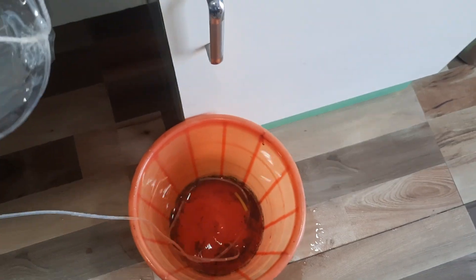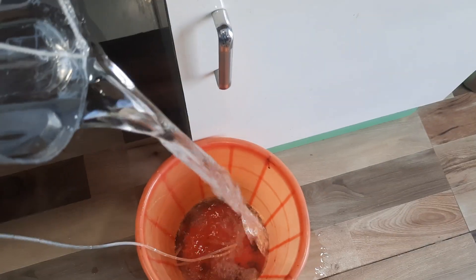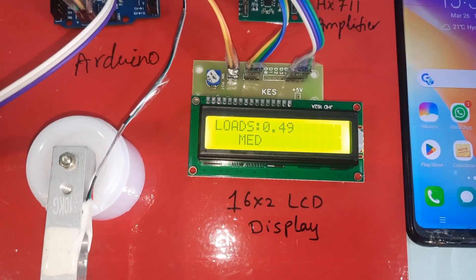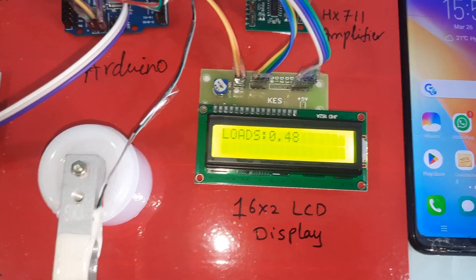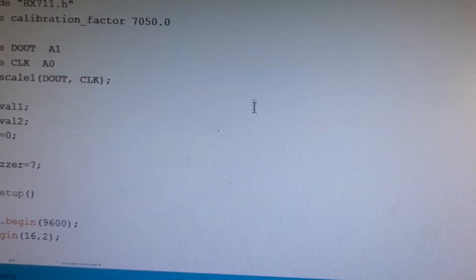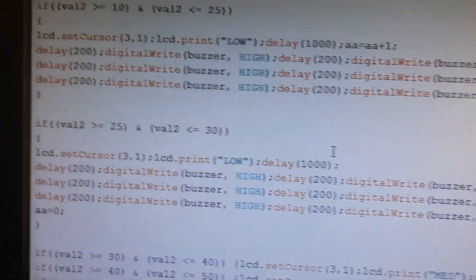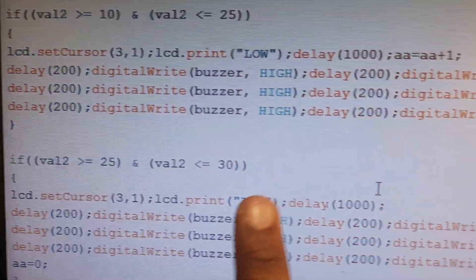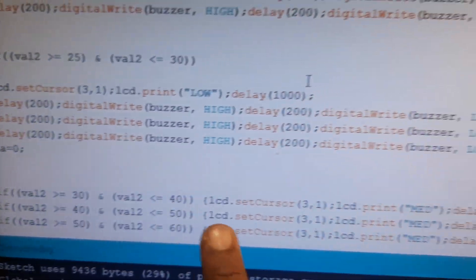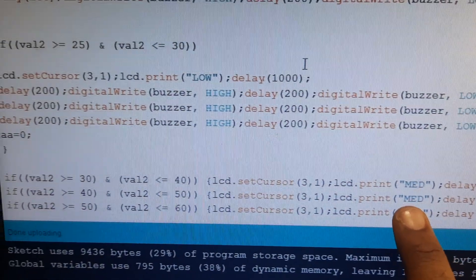Now removing some water from the bottle. The reading drops — now at 49. A loop is added. 25 to 30 is low level; below 25 triggers an SMS alert. 30 to 40 is mid level.